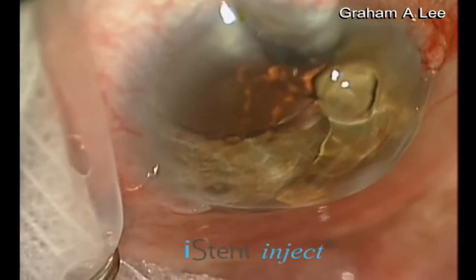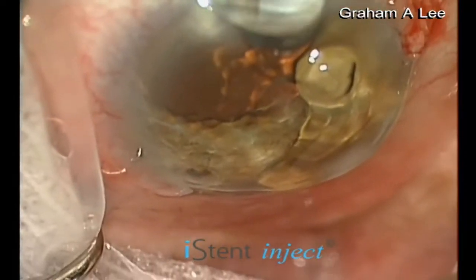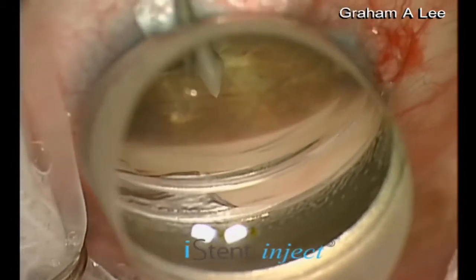This is the iStent Inject device from Glaukos. It's a heparin-coated titanium shunt, or MIGS device.